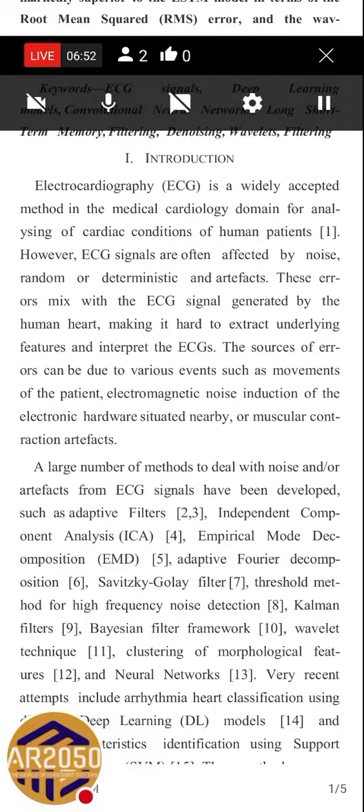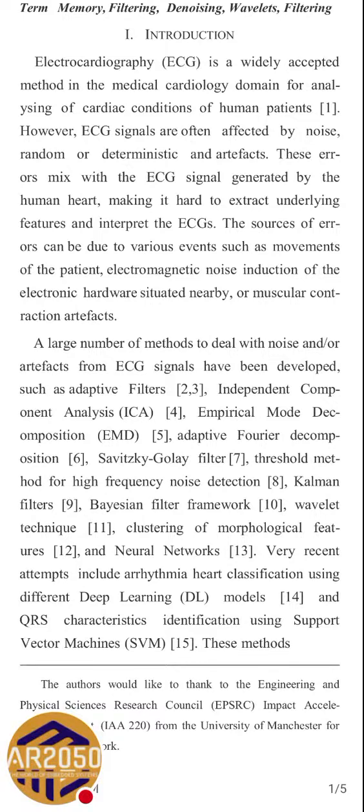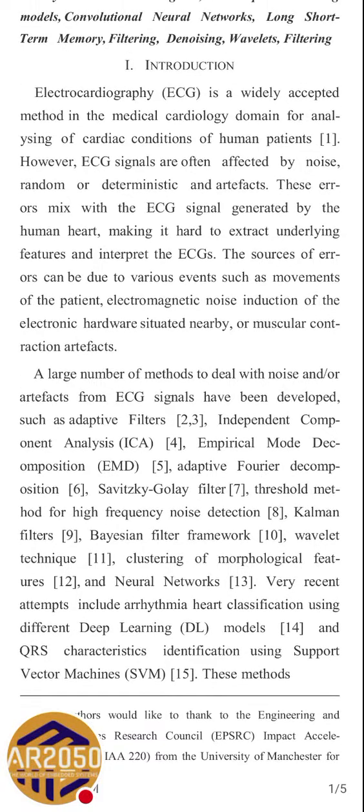The next thing we could see from this literature is the electromagnetic noise induction. In hospital settings, there is a lot of electronic machinery used for monitoring different vitals of the patients. They are electronic machines, and they have some kind of electromagnetic induction which could be imposed on other machines as well.